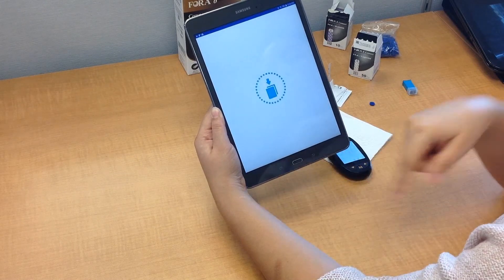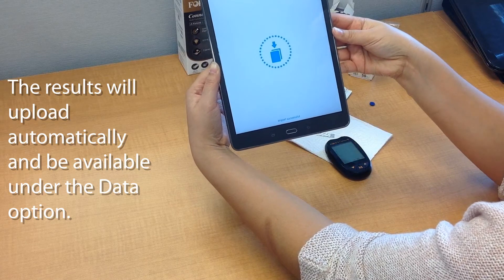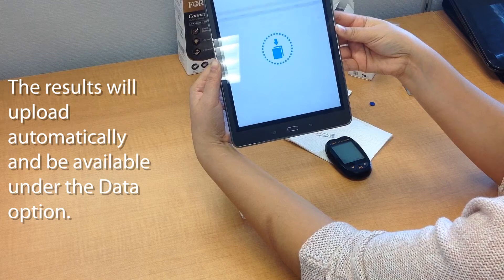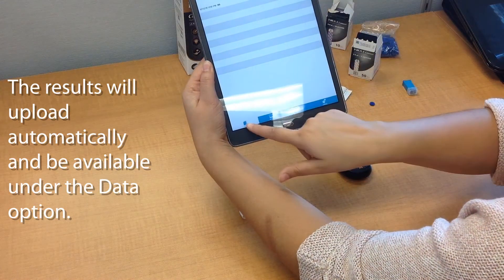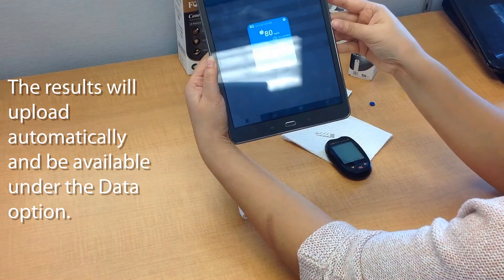That will automatically prompt the device to import all of your readings. After it's all imported, you can go to data and you will see all of your readings.